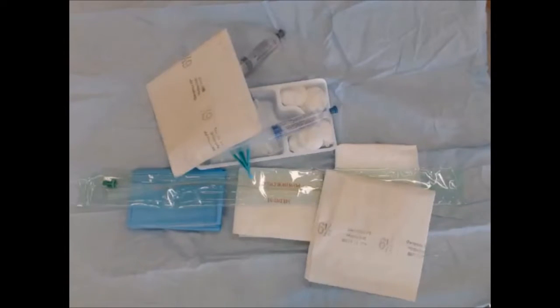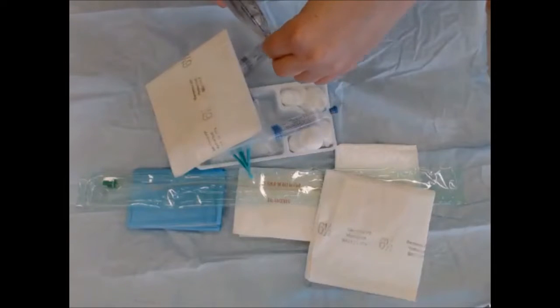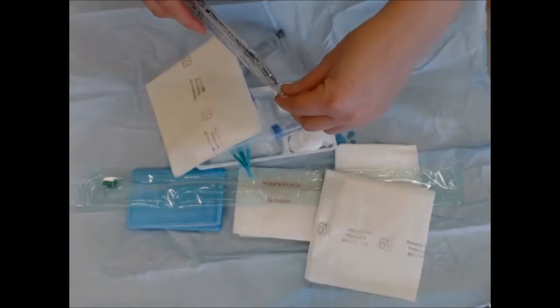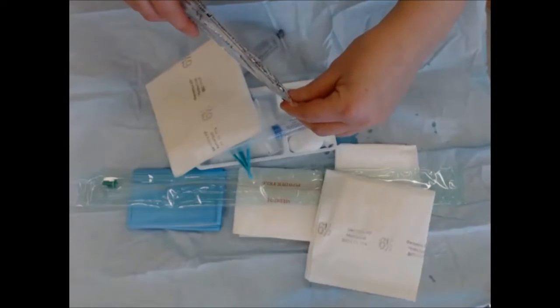The last thing you'll need is something to clean the patient with. We use Normasol, which is sterile water. It comes either in a large 100ml pack or two smaller 50ml packs — you'll need 100ml total, so use one big pack or two small ones. Pour away from the sterile field, try not to touch it, and pour the sterile water onto the cotton balls.